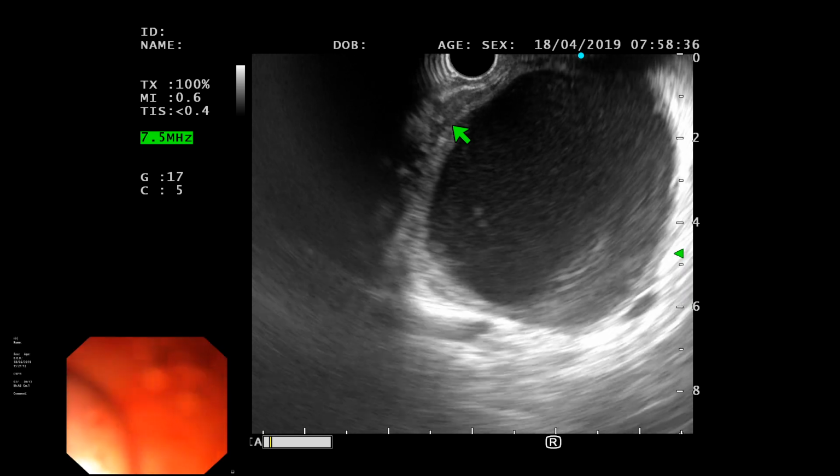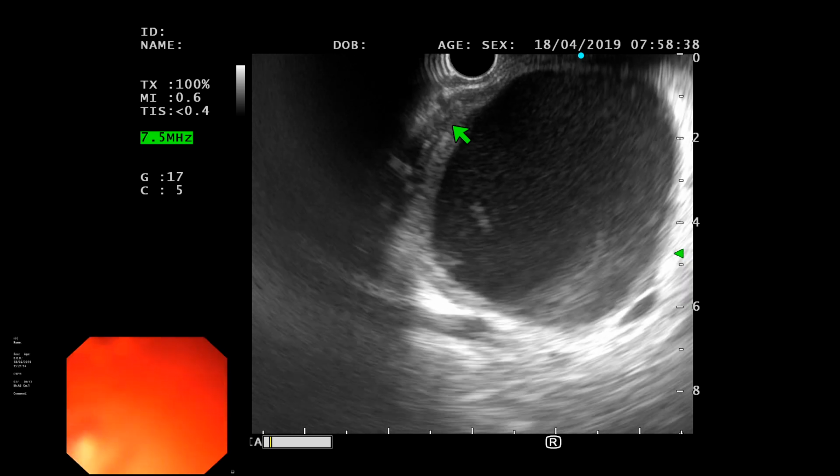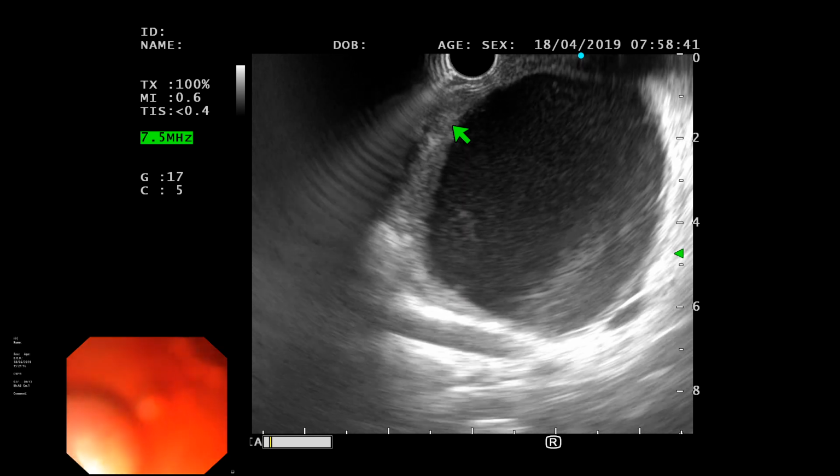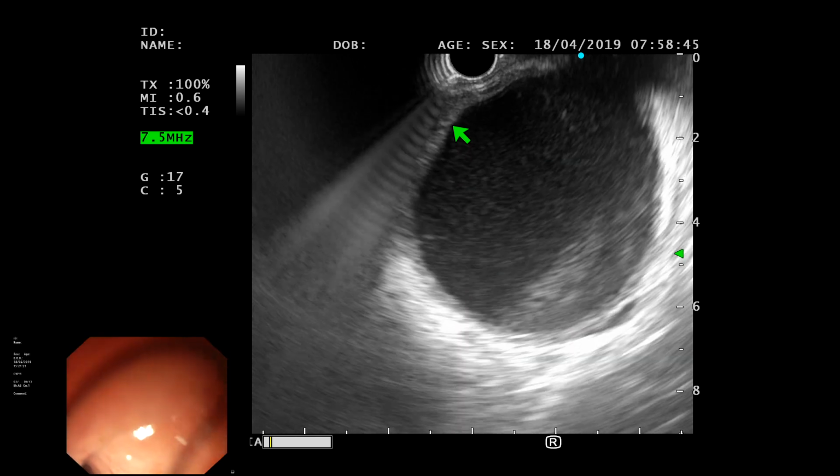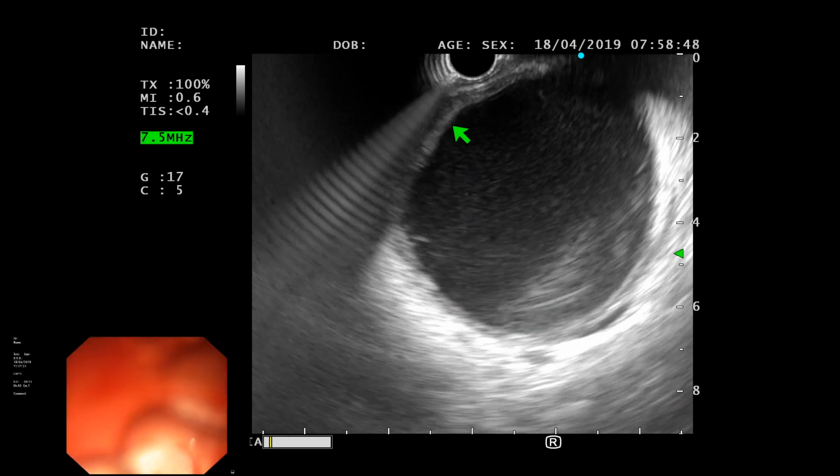It's very tempting to drain it. I know. I'm just holding your hand. Yeah, Wasim is holding my hand too, and asking me to just stay away from it.